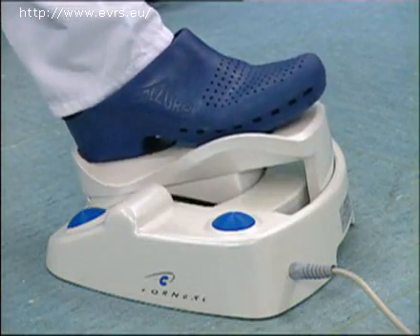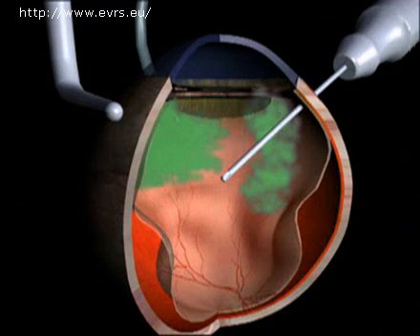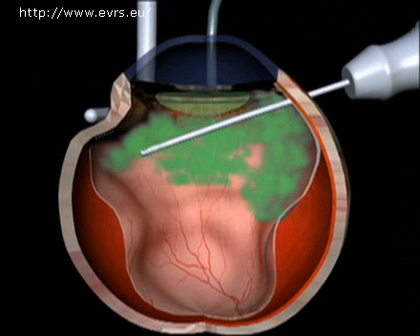With a peristaltic pump, it is possible to aspirate at less than 8 cc per minute in water by lifting up from the pedal. One can then perform this peripheral vitrectomy with more precision. 6 or 8 cc per minute is correct most of the time for a flattened retina. In contrast, when the ciliary retina is detached, these levels may already be too much. Here is an example where I created an iatrogenic tear working at 8 cc per minute and only realized what I had done at the second passage.